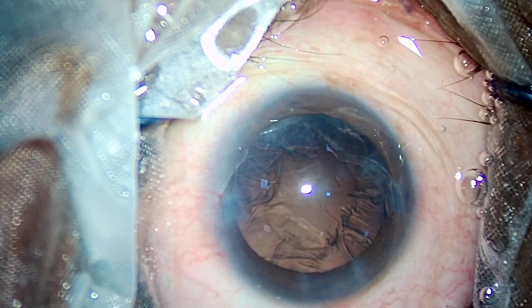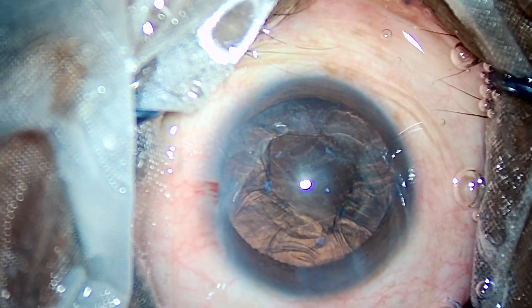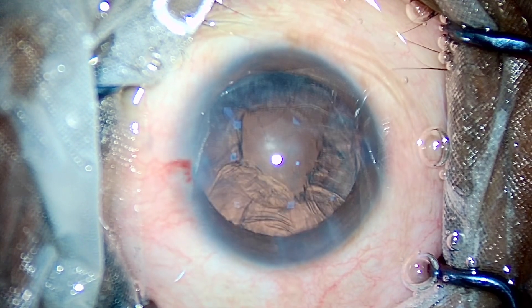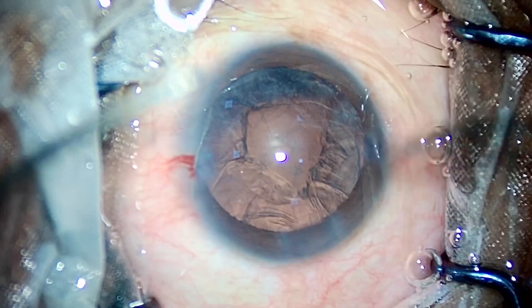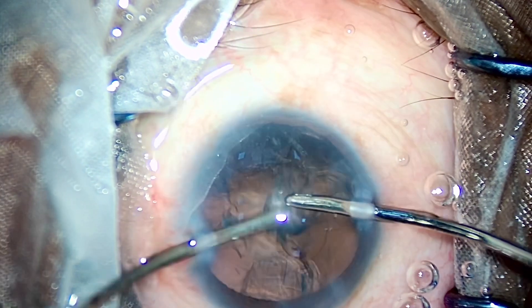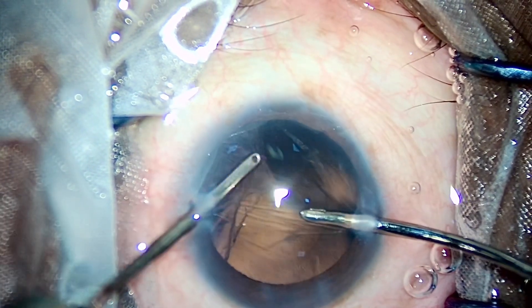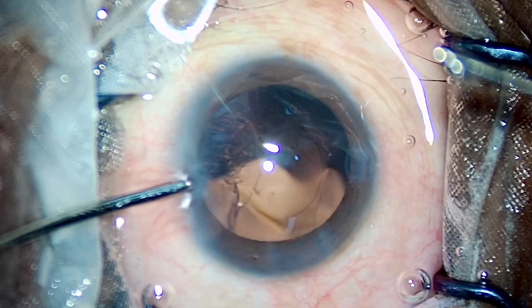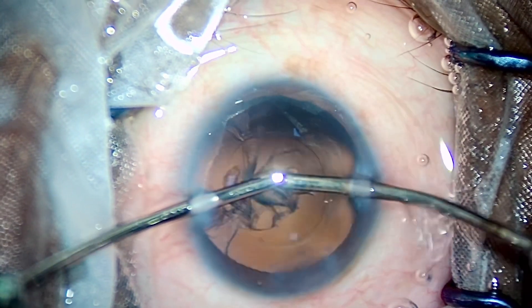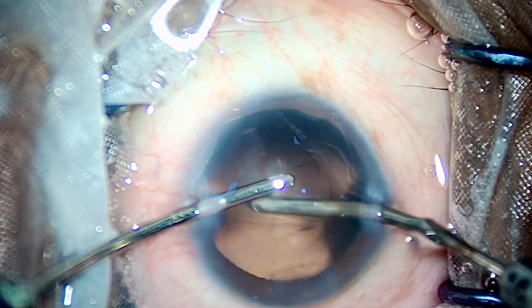Can you notice something abnormal? Wait just ten more seconds and you'll notice something strange in the posterior capsule. At this time I had not recognized what the problem is, but as soon as I am completing the IA I can see the defect. As I complete the IA part I can see something fishy — can you now see what is there?